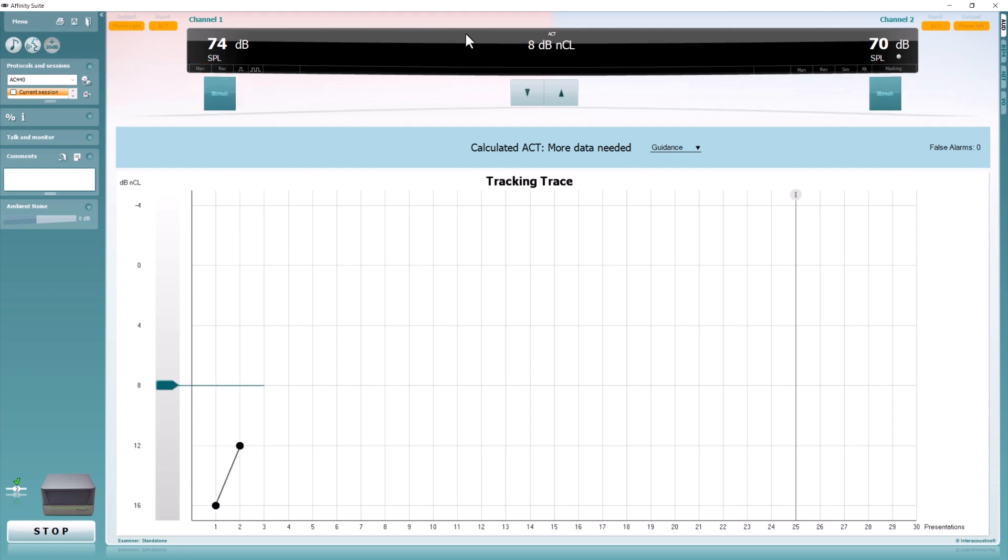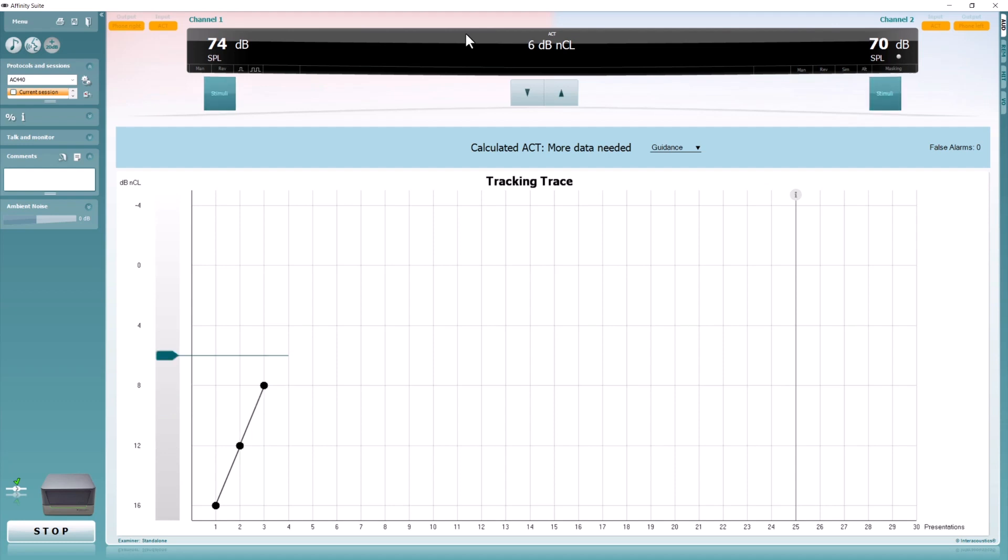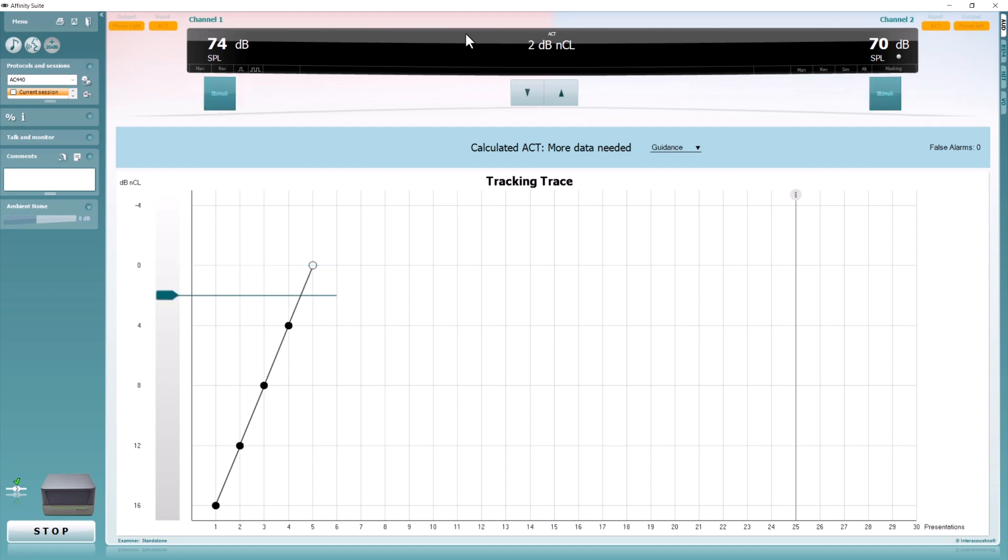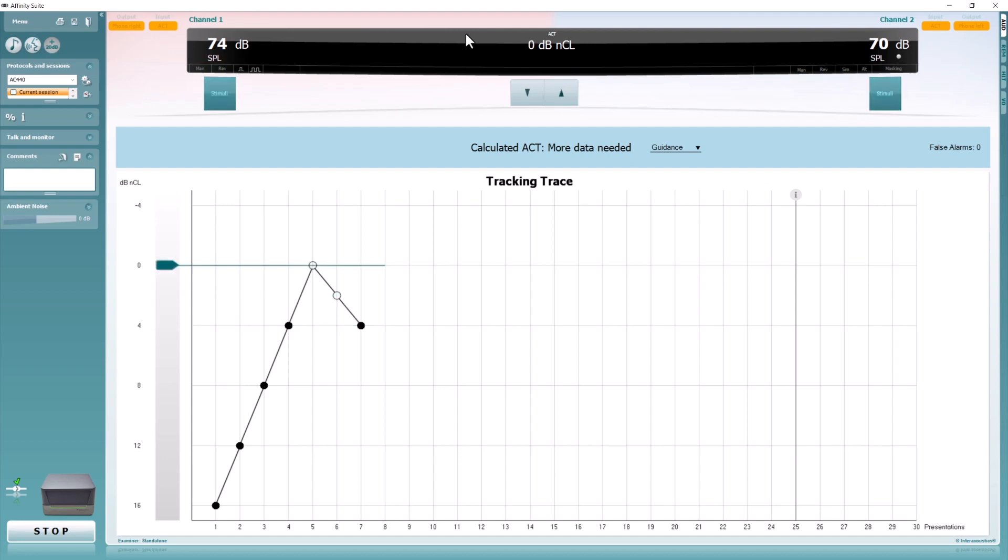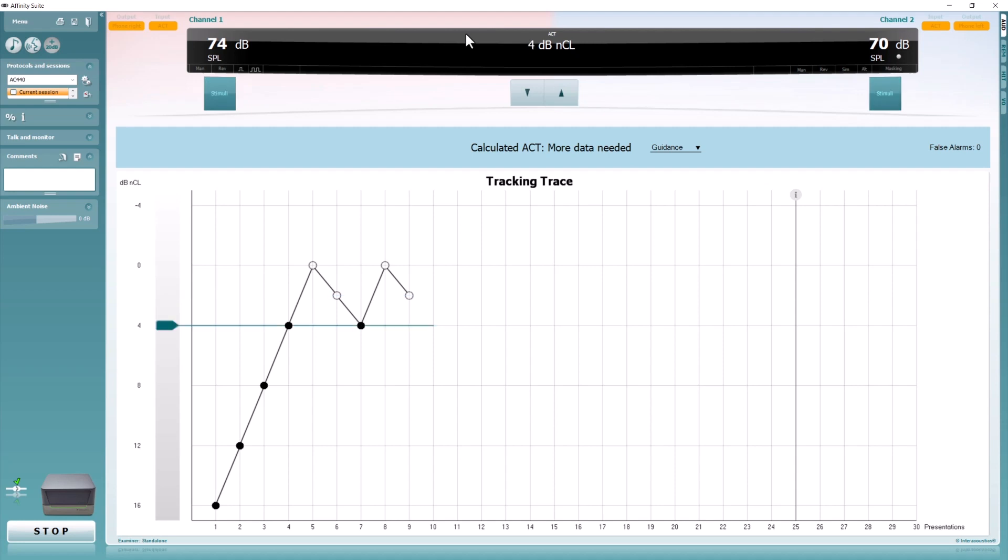You continue performing the test in the same manner as pure tone audiometry. Once a heard response has been stored, go down in intensity by two steps and present again. If the client does not hear the siren or does not respond to the sound in the correct time frame, a white dot will appear and you increase in intensity by one step. This two-down, one-up approach is the same as audiometry, and the test will automatically stop and store a value once it has reached three out of five correct responses.